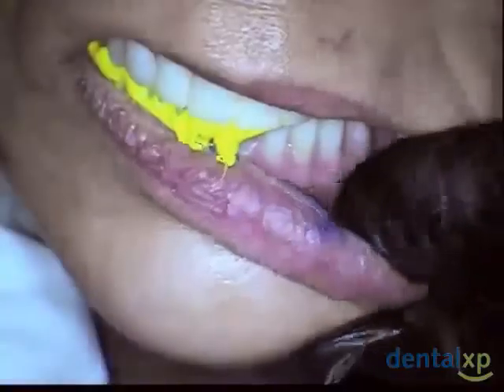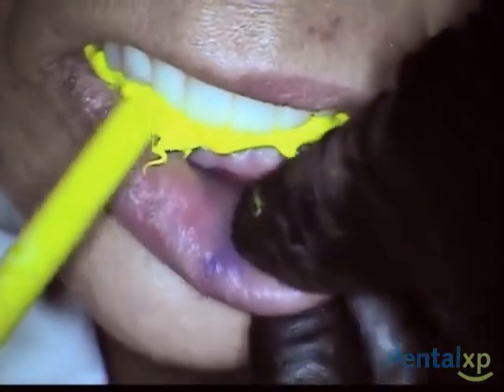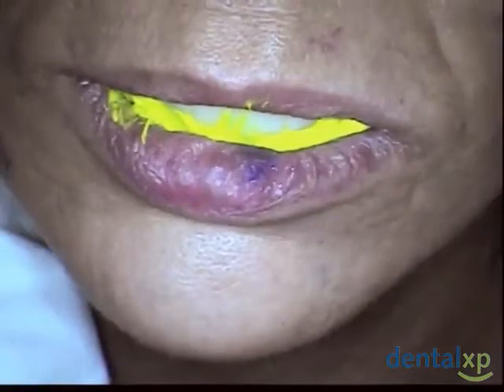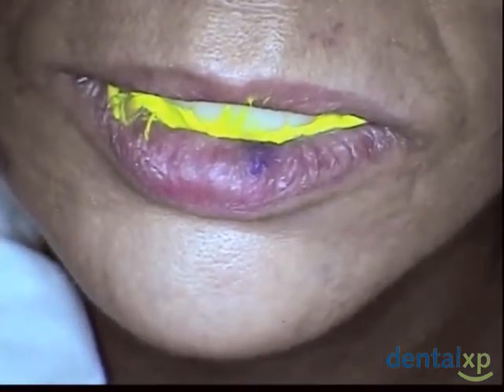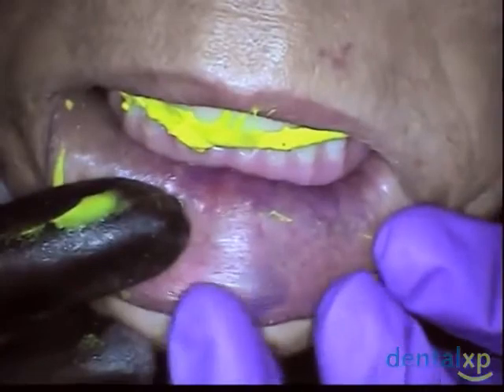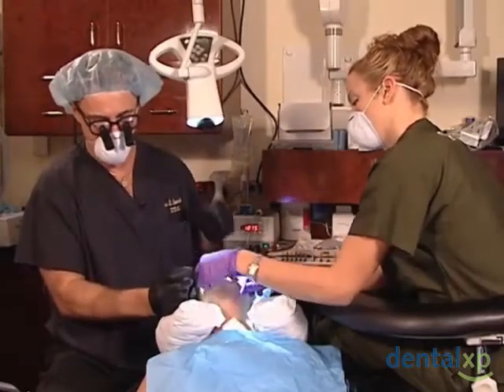They've gone from dentist to dentist trying to find a better result — asking the same question, hoping for a different answer. What we're going to try to produce at the time of surgery today is stabilize that denture, give her stability — retention is an added benefit. If we can do that, then we've given her something she's really asked for. If they have the bag of dentures, you have to select the one that will best be able to be retrofitted.